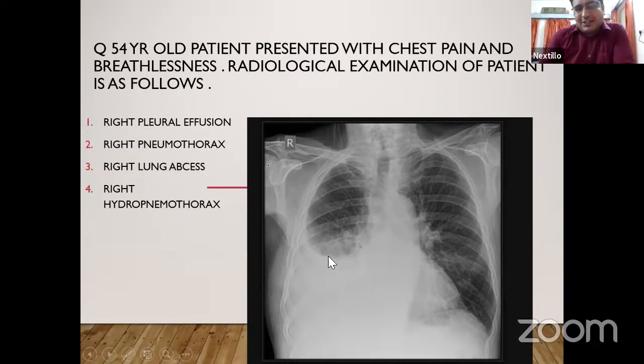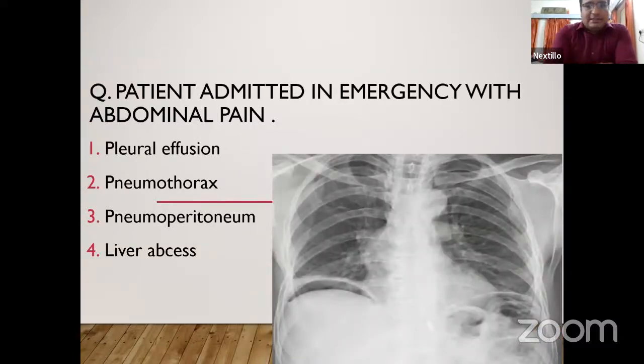So what is it that goes upward? This is fluid. This is pleural effusion: obliteration of the CP angle, obliteration of the hemidiaphragm and right heart border, and the fluid tracking upwards. Oh, very good. Students are giving very right answers. Proud moment for me. Since you are done with it, contained fluid, very good. Good answers. Well done.